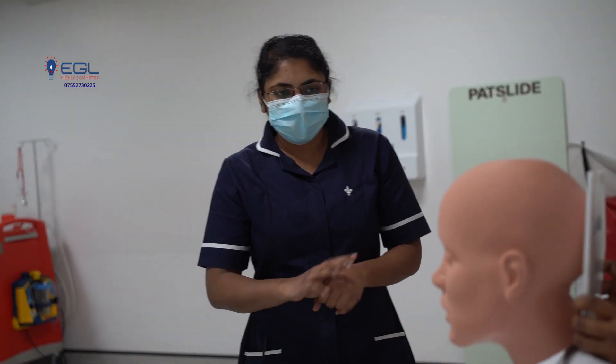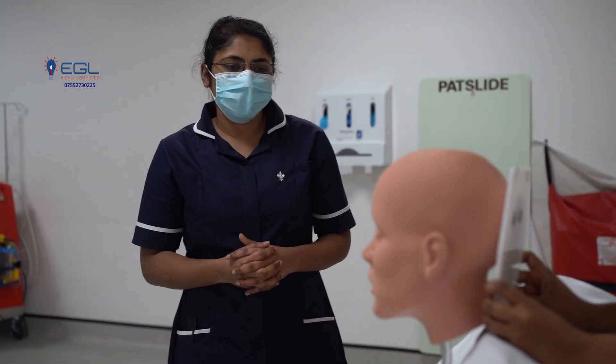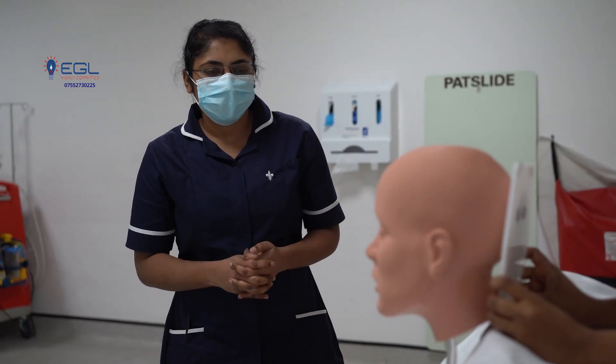Hi, good morning. Good morning. My name is Soni Joon. I am your attending nurse today. How are you? So, would you tell me your preferred name? William. Okay, William.